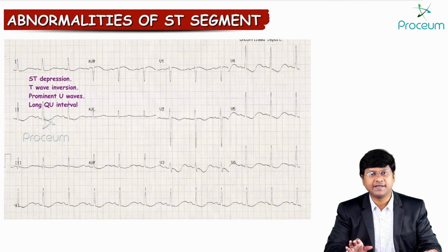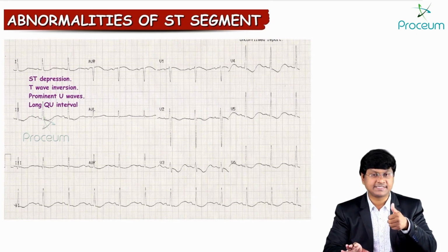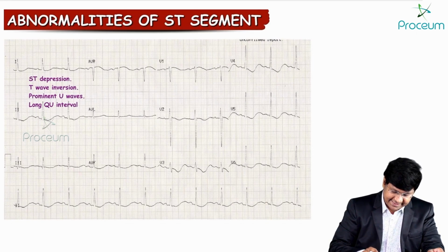So why are we discussing hypokalemia in the abnormalities of the ST segment? Because in hypokalemia you have ST segment depression. In hyperkalemia you have ST segment elevation. So that is why we are discussing hypokalemia related to the abnormalities of the ST segment.